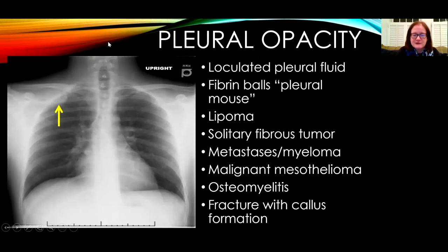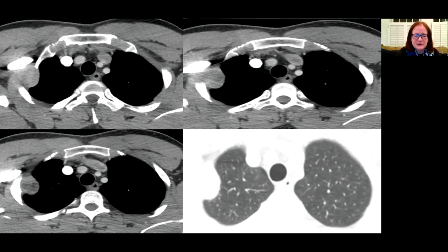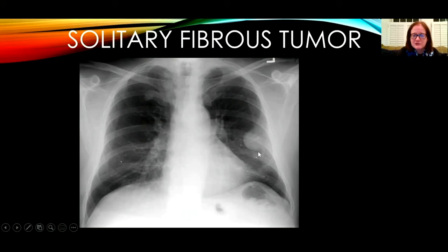Pleural opacification can result from many causes. This lesion was incidentally found in an emergency room patient — it makes obtuse angles with the chest wall and there is no bone destruction. CT shows a heterogeneous mass making obtuse angles with the chest. This turned out to be a benign pleural fibroma, resected because of the risk of transformation to malignancy. Solitary fibrous tumors can be quite mobile and soft, and they often have an appearance draped over the chest wall.